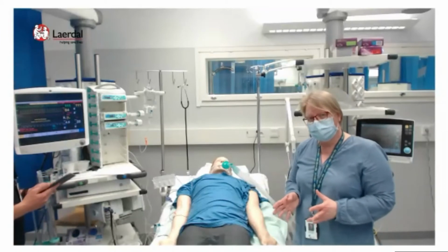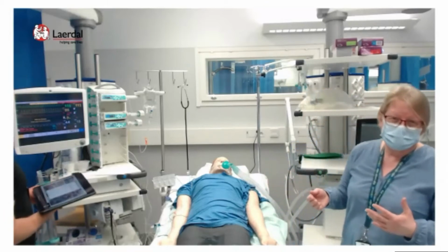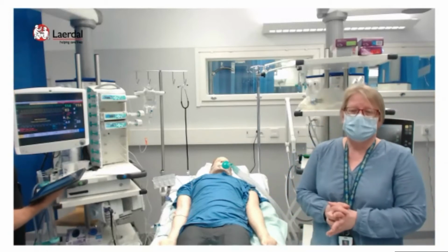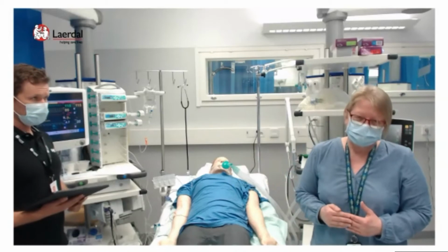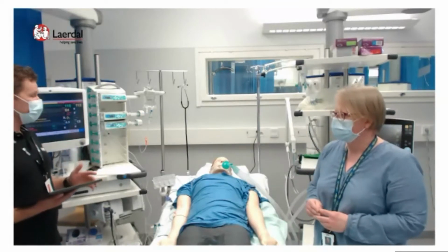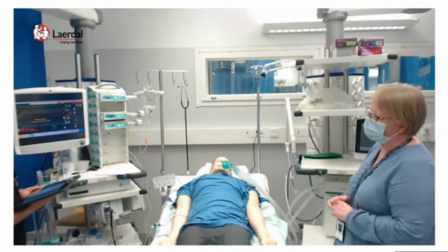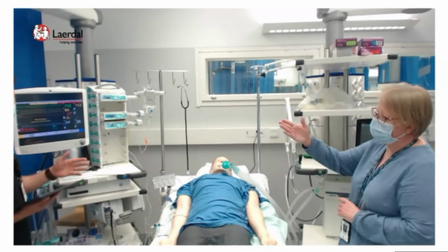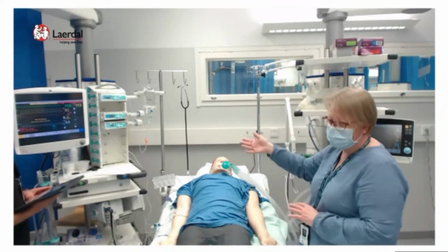In our ICU, the nurses do lots of adjustment of ventilators. But in this kind of situation, they might ask the doctor, and we have lots of young residents who are very familiar with the operating theater, but not so familiar with ICU patients. Should we go through what we have done so far? Basically, the situation hasn't changed much from the beginning. The saturation is still low. What's the clinical status of the patient now? Blood pressure is also a little bit lower, but we gave him sedation: propofol, midazolam, fentanyl, and so on.